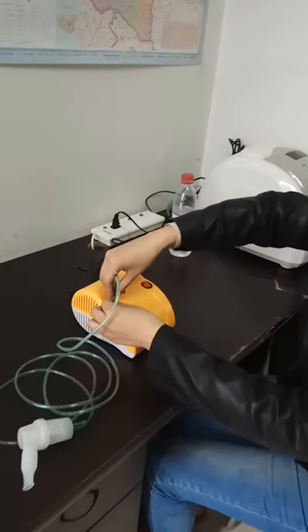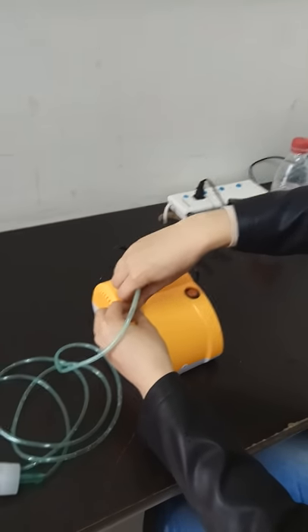At first, link the tube together with the nebulizer machine.